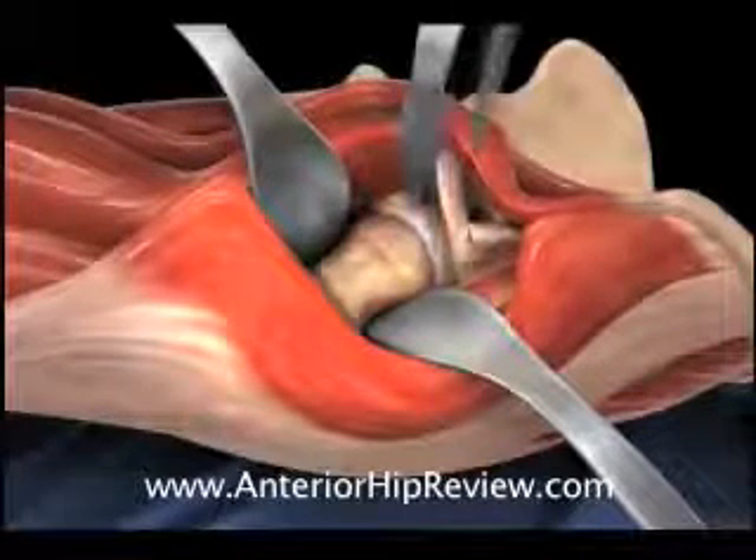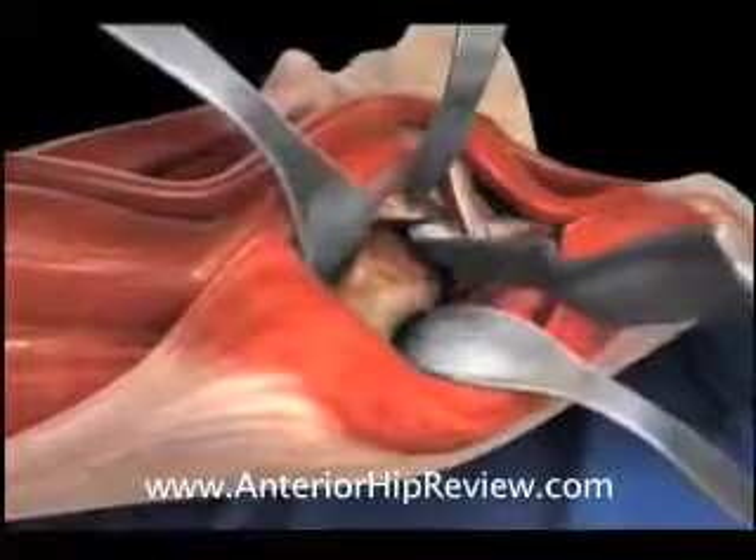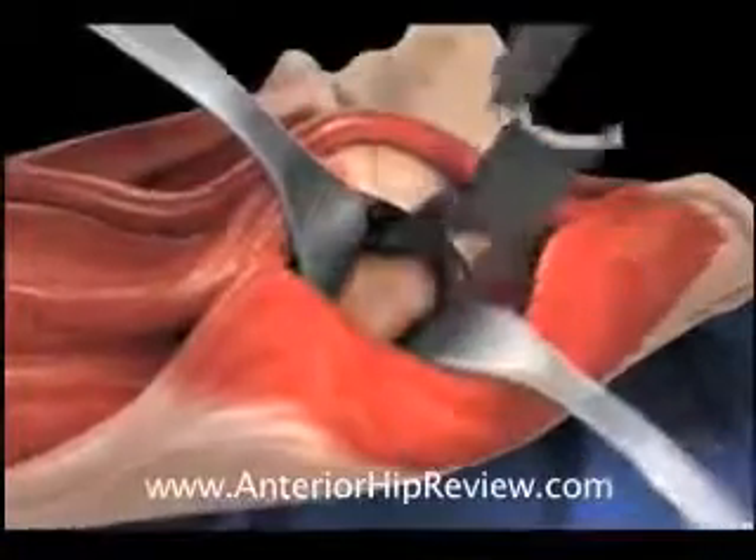At this stage, the hip can either be resected in place or it can be dislocated prior to making a femoral neck cut. In this animation, we demonstrate dislocation of the hip prior to making the femoral neck cut.